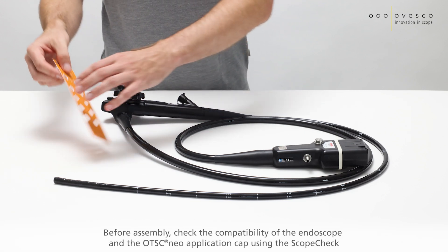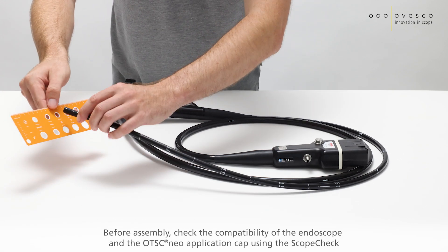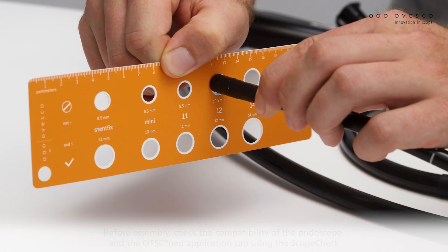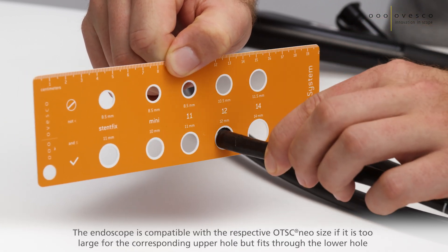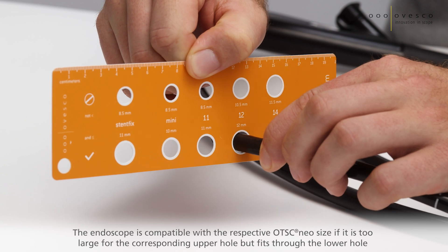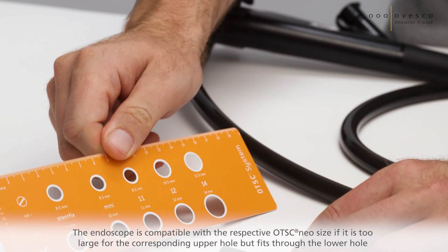Before assembly, check the compatibility of the endoscope and the OTSC NEO application cap using the scope check. The endoscope is compatible with the respective OTSC NEO size if it is too large for the corresponding upper hole but fits through the lower hole.